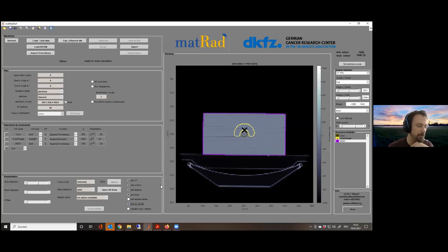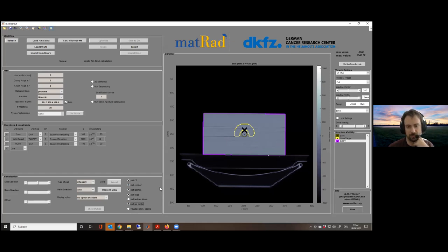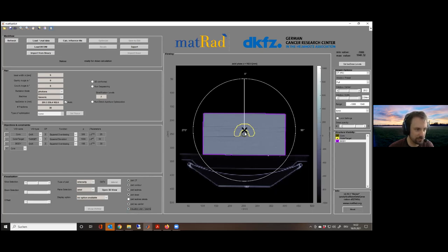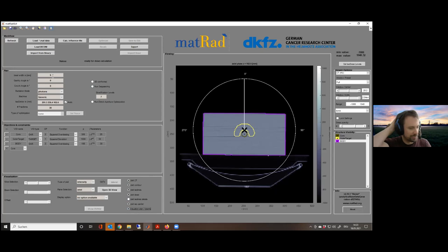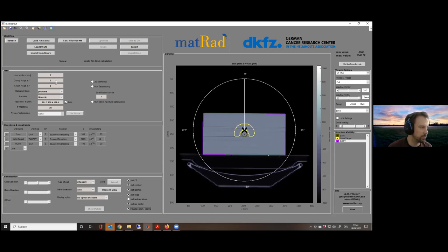You can also trigger contours — turn them on or off, which is sometimes useful when looking at the dose. The cross in the middle gives you the isocenter of the plan, which you can also turn off. The isocenter is basically the center of rotation you assume for your gantry — a reference point that the planning system and the machine both understand.